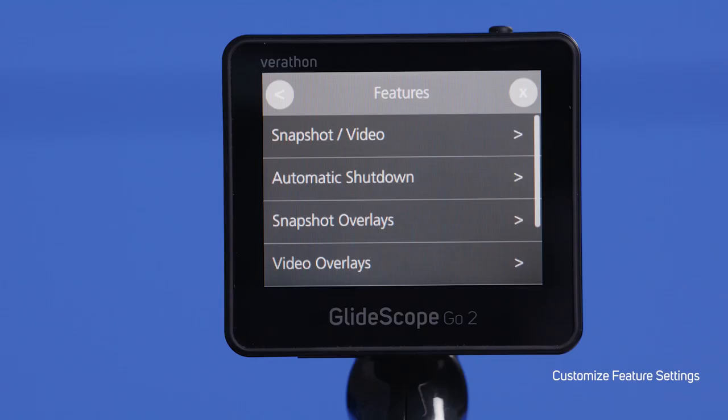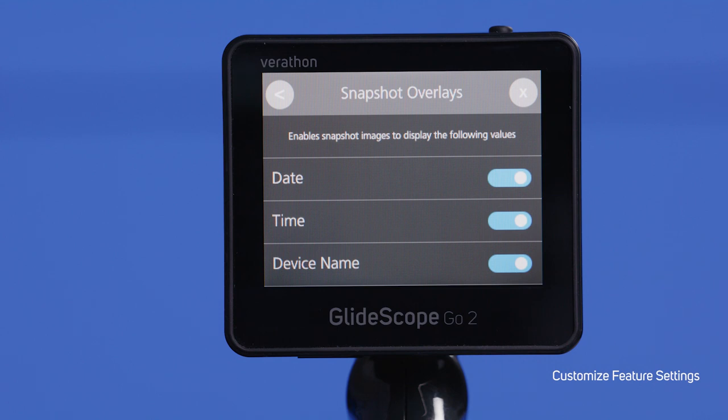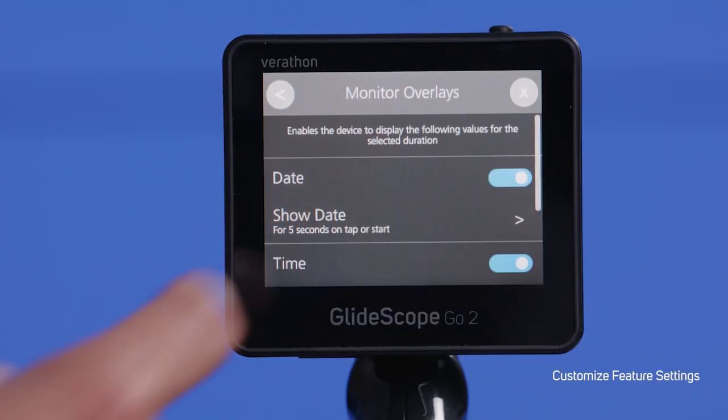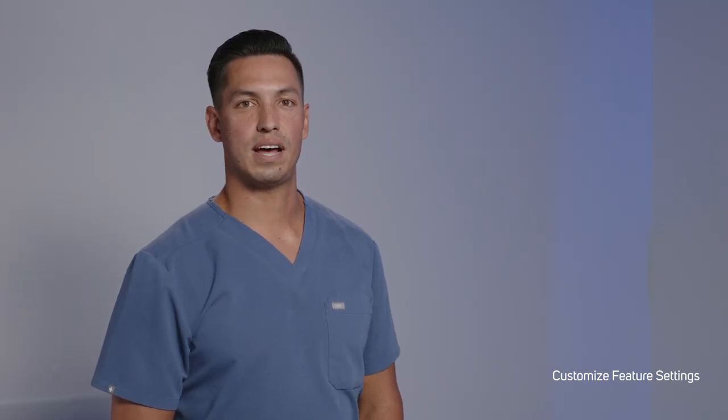Under Features, you can modify the overlays shown on video recordings and snapshots. You can choose to keep or remove the date, time, and device name. Toggle the button to turn these off and on. For monitor overlays, you can remove the date and time stamps as well as the device name. You also have the option to have date, time, and device name appear for 5 seconds, then disappear.